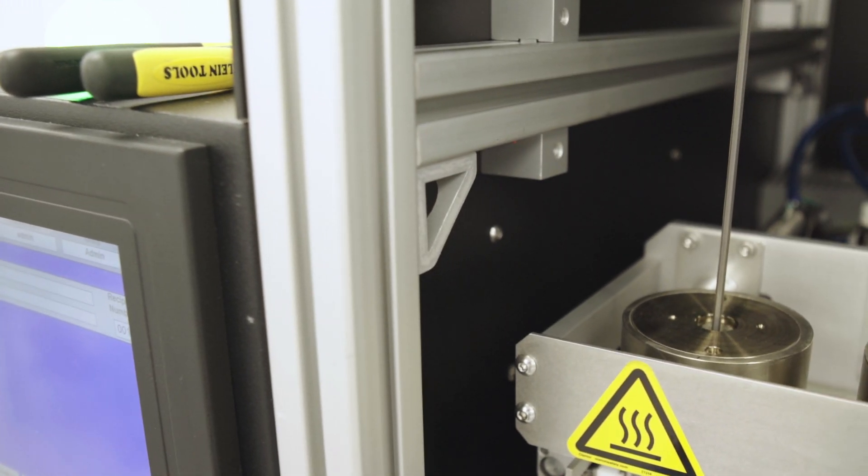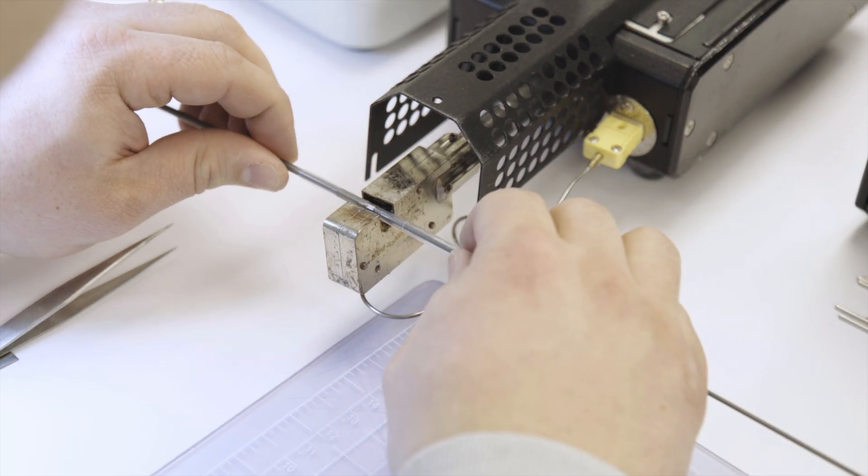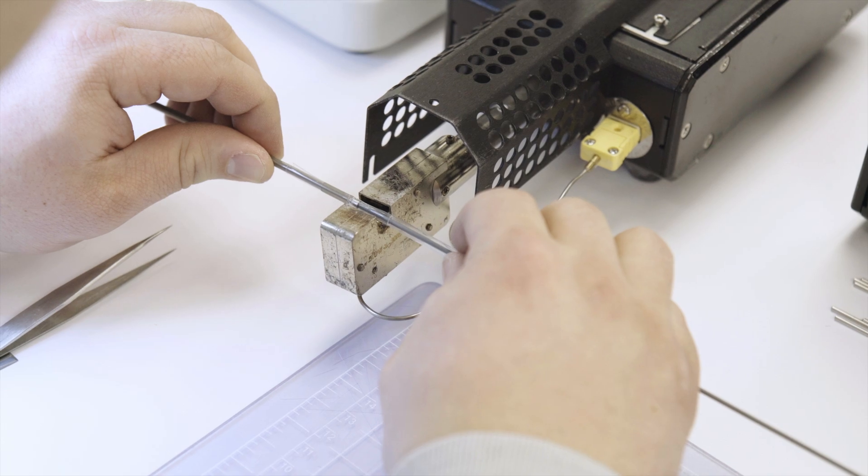As steerable catheters continue to grow in popularity, our hope is that PTFE sublite wall multi-lumen tubing can not only save you time and money, but enable you to design more advanced devices to deliver cutting-edge therapies. Let us know what we can do for you — we're here to help.